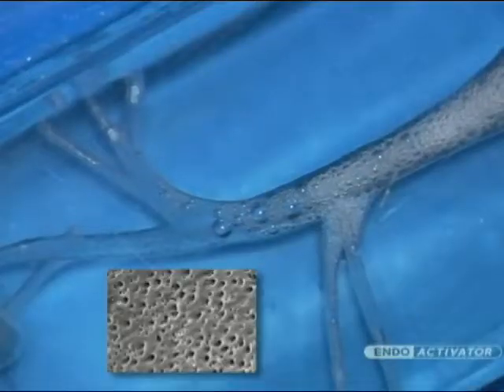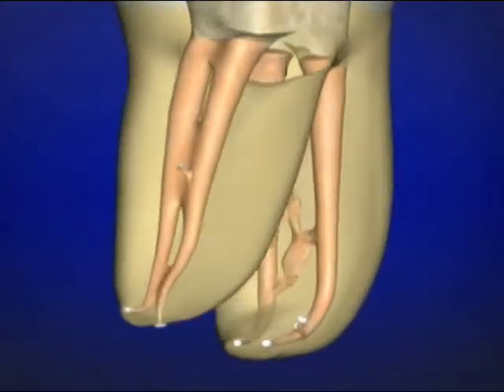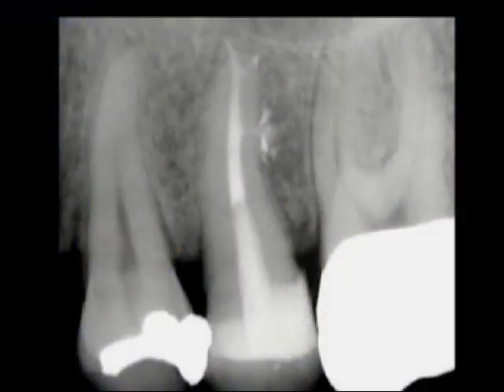Implosions radiate shock waves that promote deep lateral cleaning. Studies have shown that fluid hydrodynamics produces cleaner root canal systems. Logically, better cleaning improves the potential for three-dimensional obturation and long-term success.